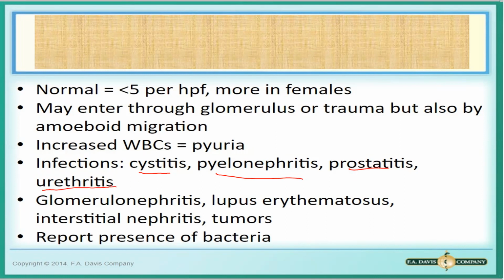Ito po yung nandun sa blank ninyo. Inflammations because of glomerulonephritis, lupus erythematosus, interstitial nephritis, and tumors. So these are the inflammation.